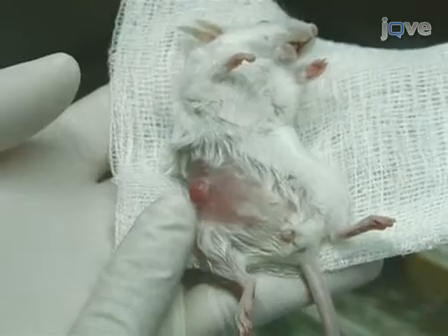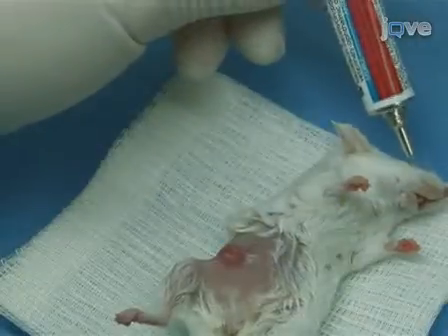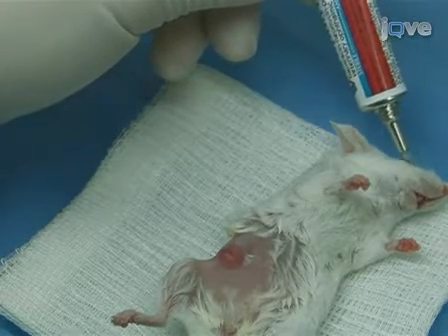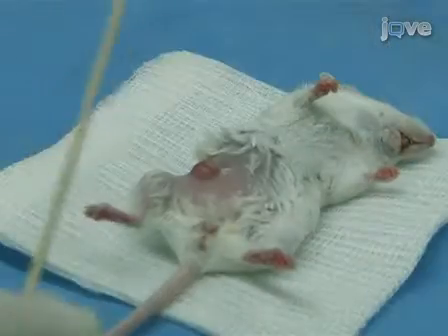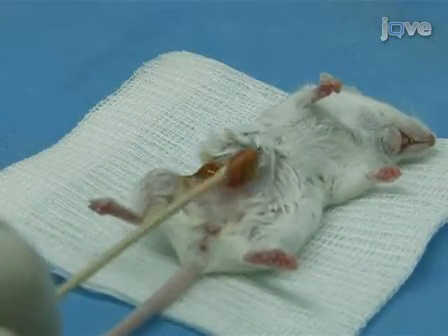Transfer the animal onto the sterile gauze and apply ophthalmic ointment to the eyes to keep them from drying out and becoming infected. Sterilize the skin with betadine and then clean it with 70% ethanol.